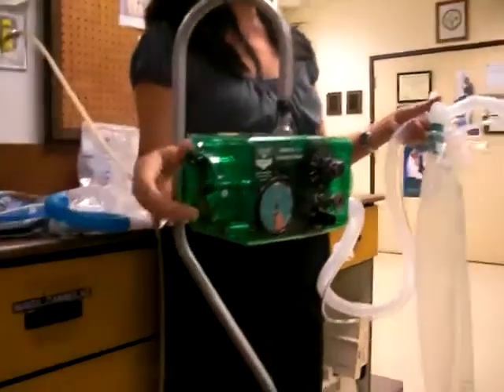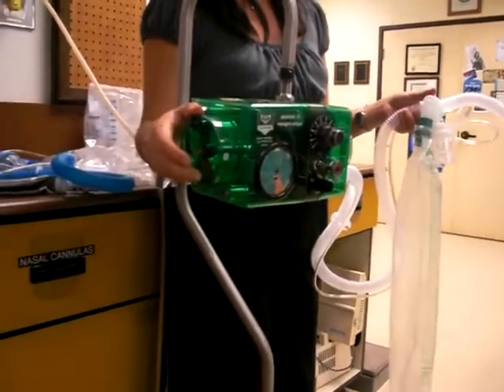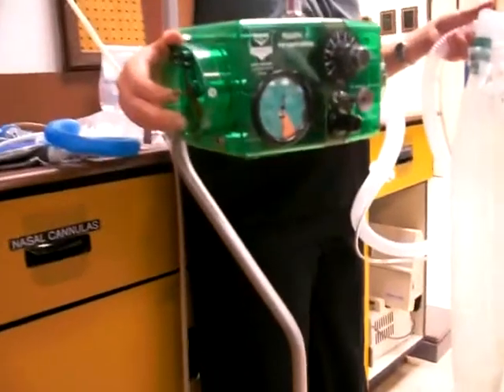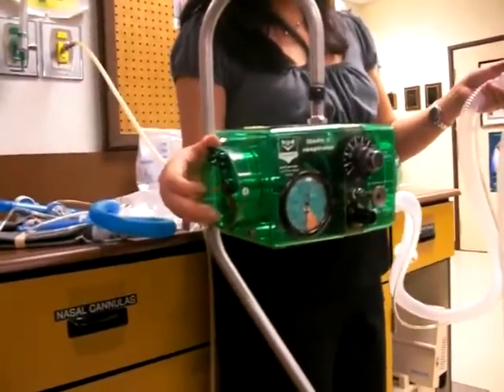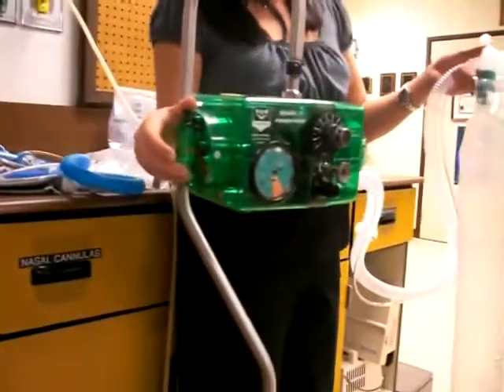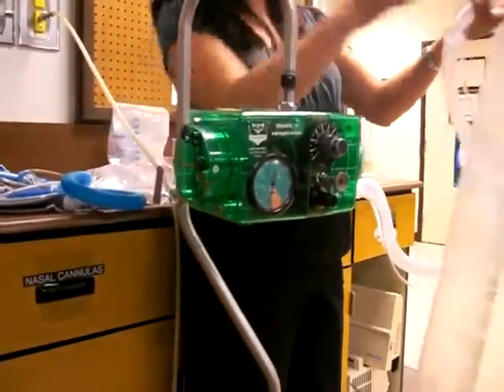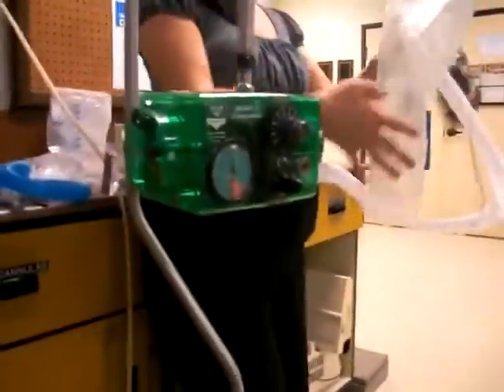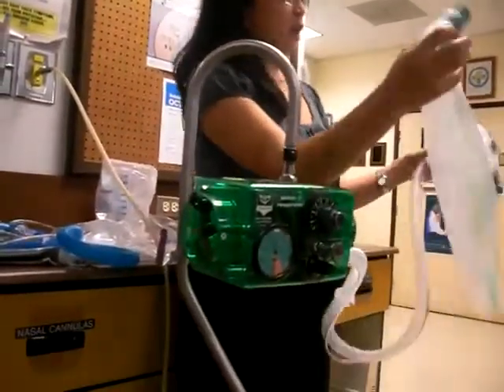1, 2. What's the pressure, Jess? 3, 4, 15, 5, 6, 7, 8. Takes about 8 breaths. It's about 600. Yeah, 600 cc's tidal volume. Okay. So, what else did you notice about the breath?